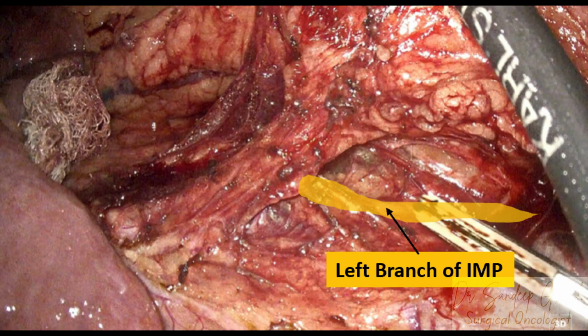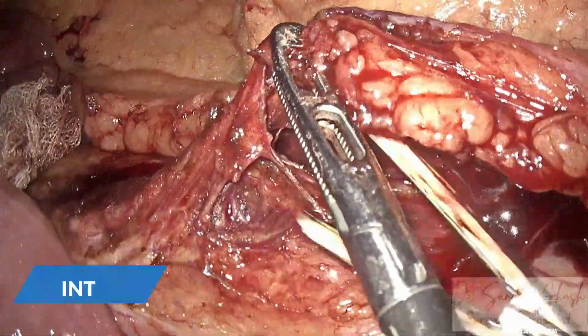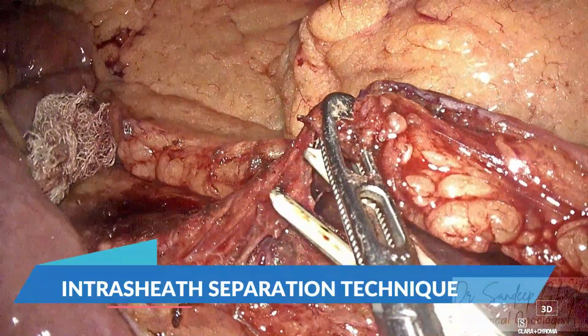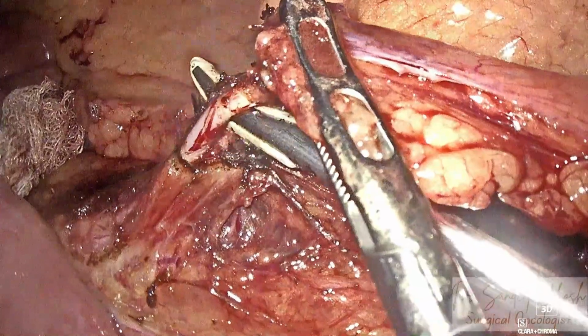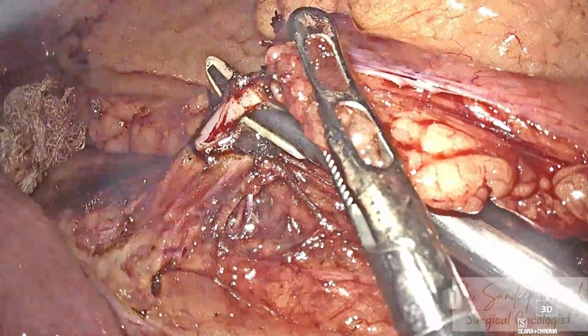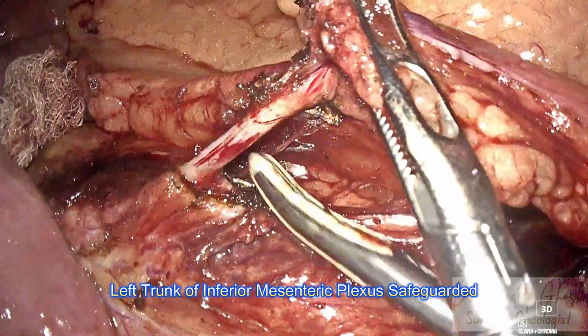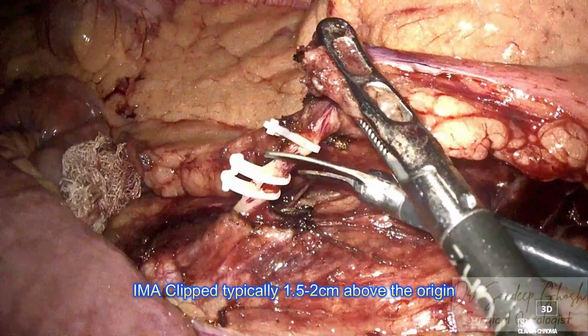Now we're proceeding with the high ligation of the IMA. Here we do the intra-sheath nerve separation technique, where the sheath around the IMA is cleared off circumferentially before we clip the IMA. This safeguards the left trunk of the inferior mesenteric plexus from injury.